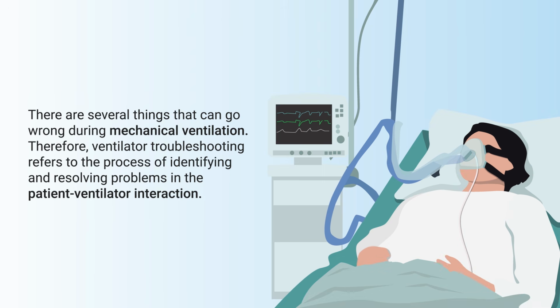There are several things that can go wrong during mechanical ventilation. Therefore, ventilator troubleshooting refers to the process of identifying and resolving problems in the patient-ventilator interaction.